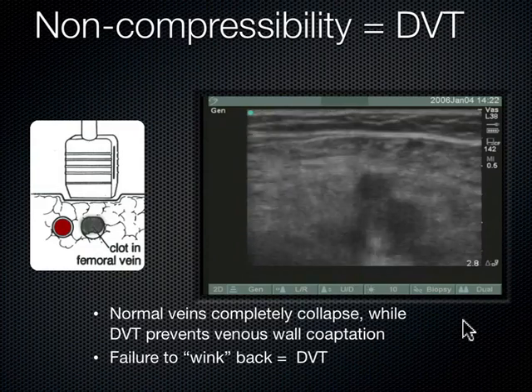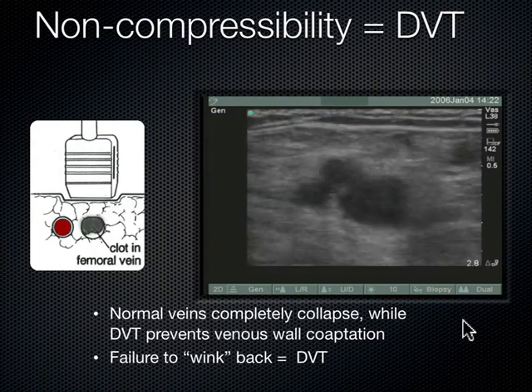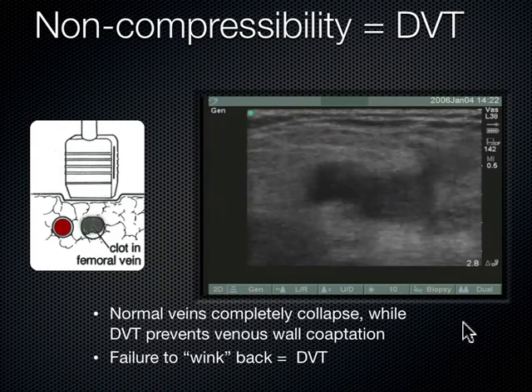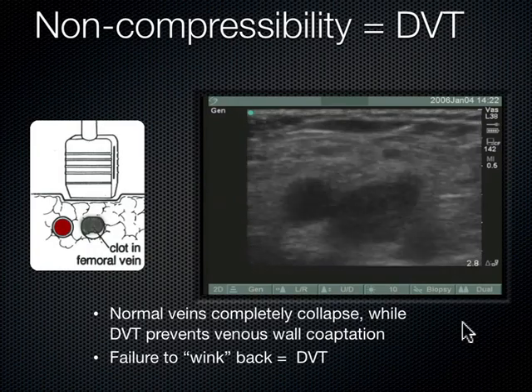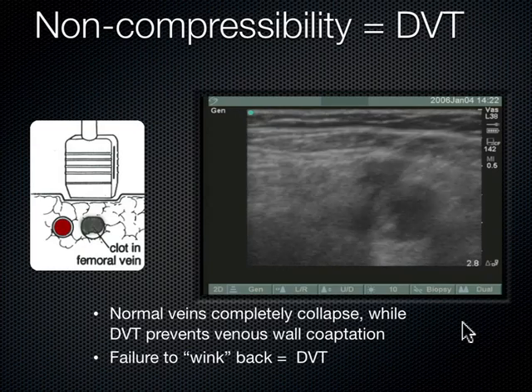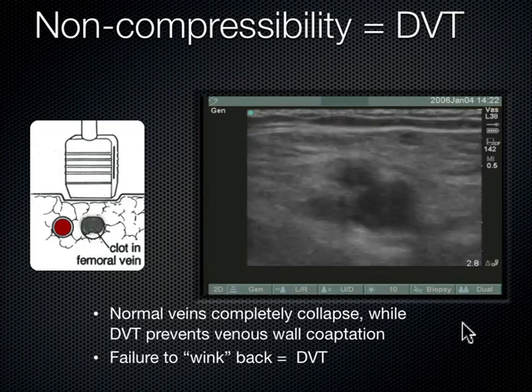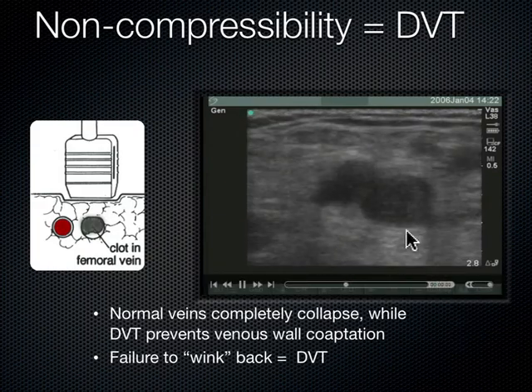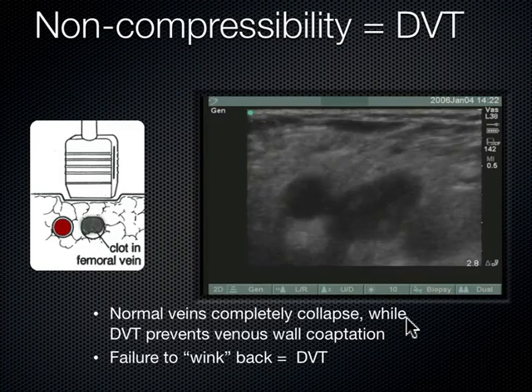Now we're going to look at what it looks like when we have a clot. You can see this structure here is not compressible. We can see the femoral artery winking back at us, and here's our clot. Once you identify that somebody has a clot in their groin, I stop compressing and say this patient has a clot. At this point I need to treat it — any more perturbation could dislodge the clot.